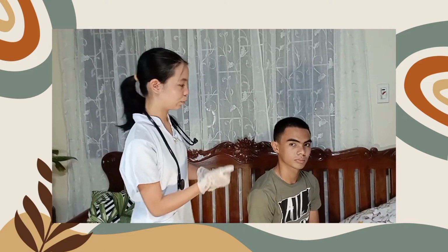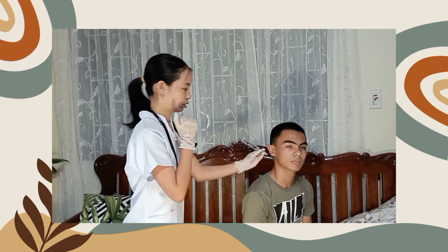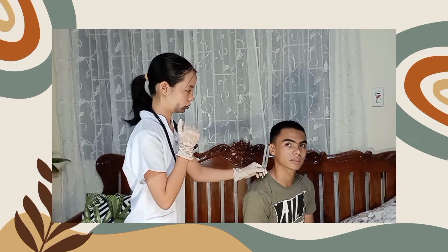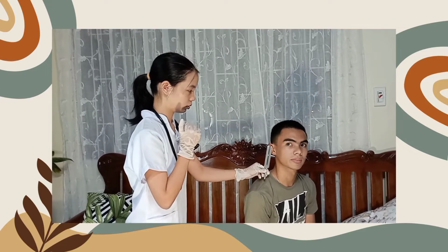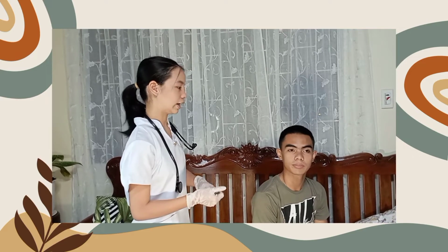So, i-activate ko na po yung tuning fork, sir. So, sabihin niyo na po sa akin kung nawala na po yung sounds. Okay, sir, upon performing the Rinne test po, may narinig po ba kayo sa air conduction? Yes po. How about sa bone conduction po? Yes po. Okay, thank you, sir.